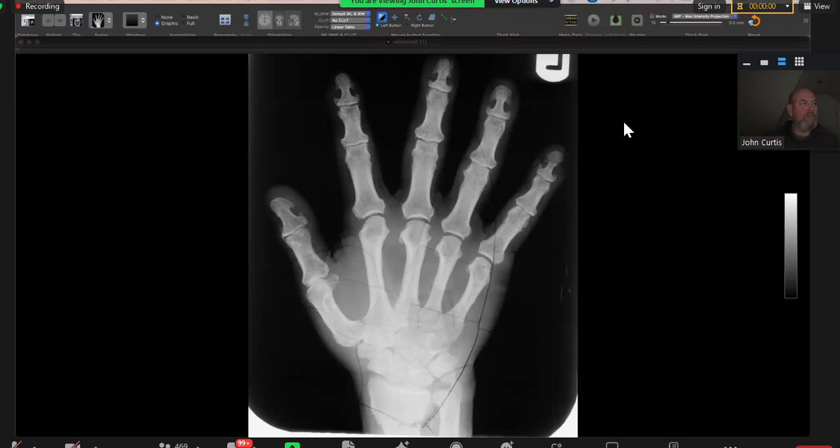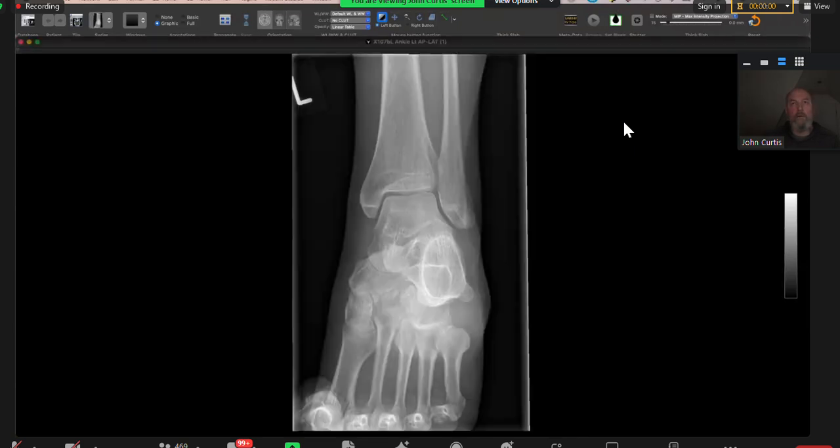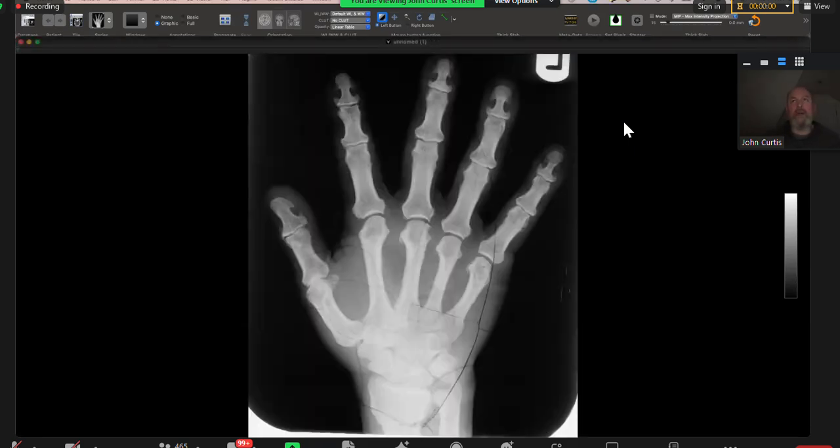And there is also the... no, that's it. That's fine. Sorry, what were you going to say? No, I was just going to explain the other findings along the proximal phalanges. That's fine. Let's go through that again then. You've smashed it to the boundary, but go on. You want to go for more? That's fine.